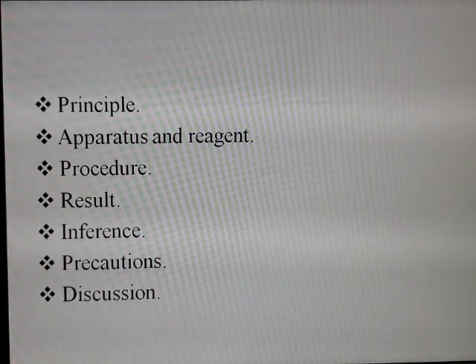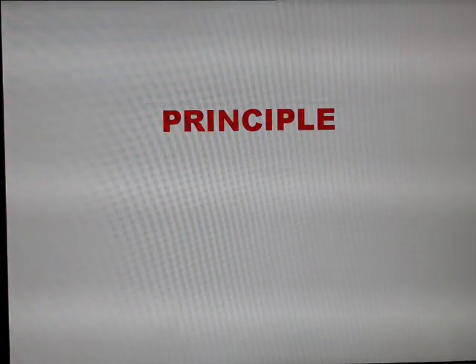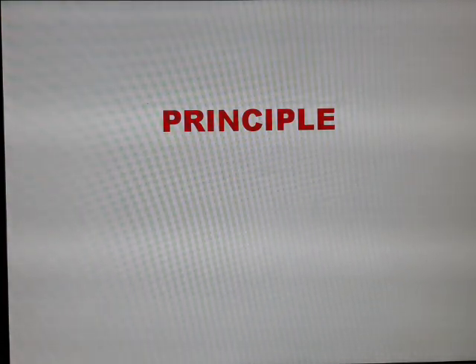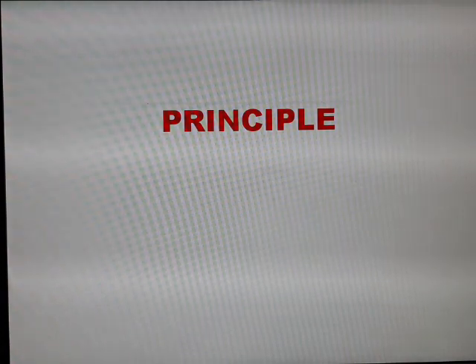and lastly discussion. So, principle: a reticulocyte is the immediate precursor of red blood cell and is a non-nucleated cell like red blood cells.